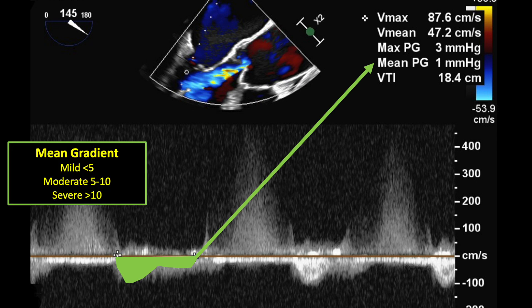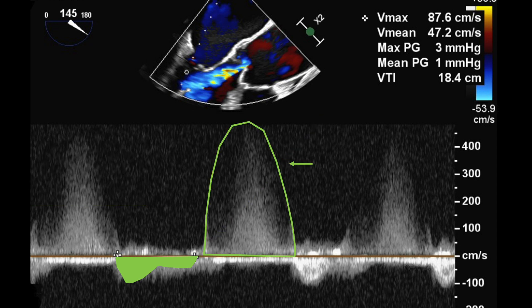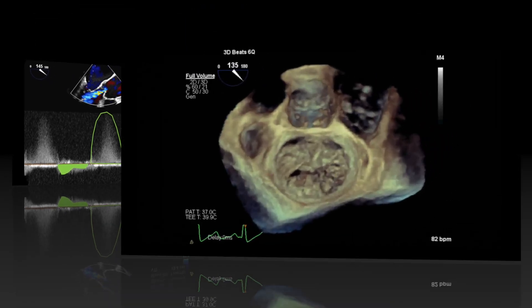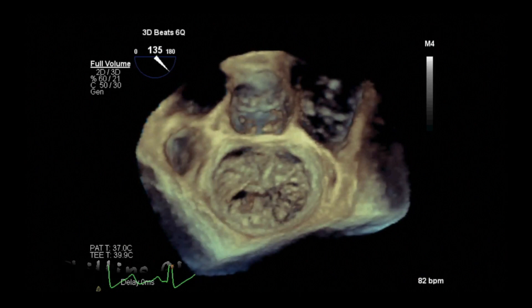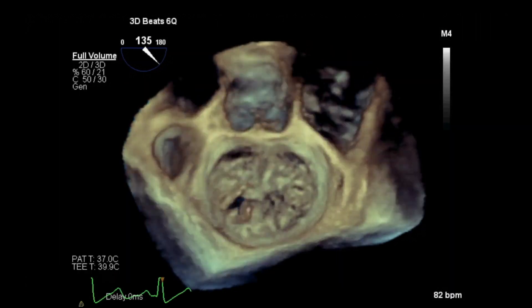If there is significant mitral regurgitation, the continuous wave density above the baseline is a quick qualitative way to gauge severity of mitral regurgitation. I then go on to manipulate my 3D clip of the mitral valve.